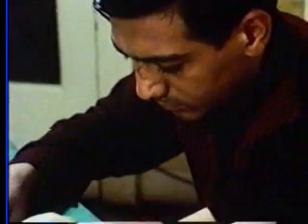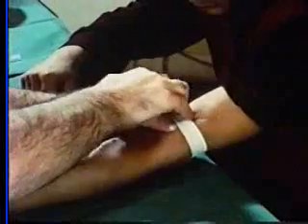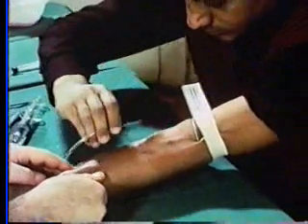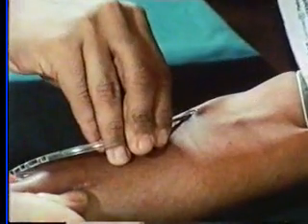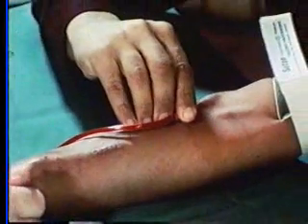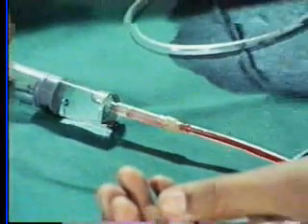His brother now applies a tourniquet above the elbow. The patient takes the main fistula needle and inserts it into the vein. The heparin loading dose is administered from a large syringe after the tourniquet has been released.